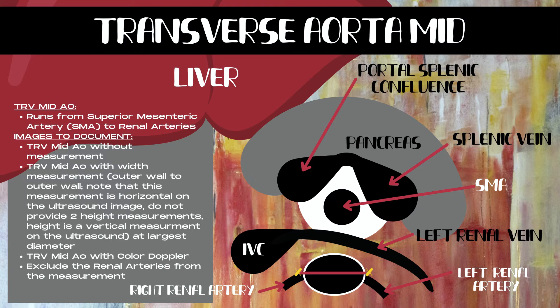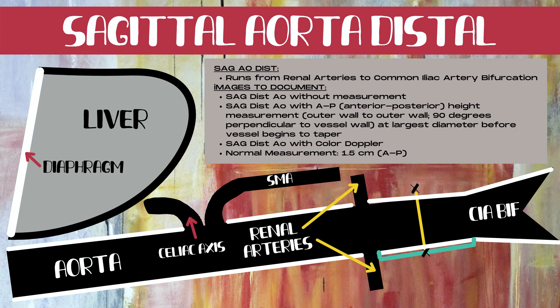Moving more inferiorly to the sagittal aorta distal, which runs from the renal arteries to the common iliac artery bifurcation. First, sweep medially and laterally through the aorta looking for dissections or pathology. Then take a sagittal distal aorta without measurement, a sagittal distal aorta with an AP or height measurement — outer wall to outer wall, 90 degrees perpendicular, at the largest diameter just before the vessel begins to taper toward the common iliac bifurcation — and a sagittal distal aorta with color Doppler. A normal measurement for the distal sagittal aorta is 1.5 centimeters in the AP dimension.